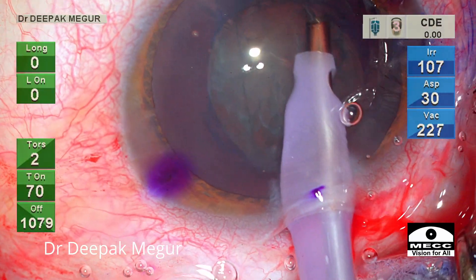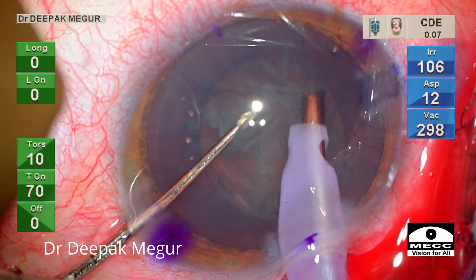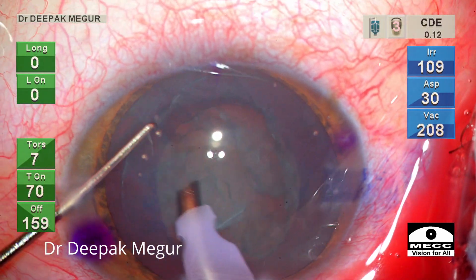Aspirating out the soft nucleus in a young patient is very easy. Very little phaco energy is needed, and in a matter of a couple of minutes the entire nucleus is aspirated out.